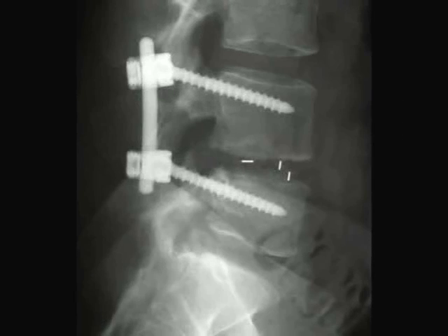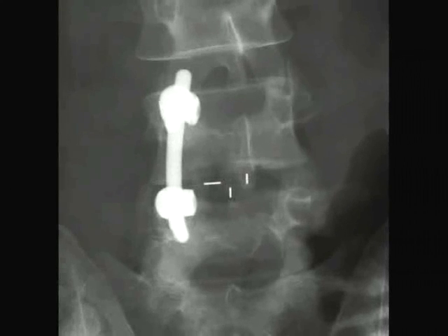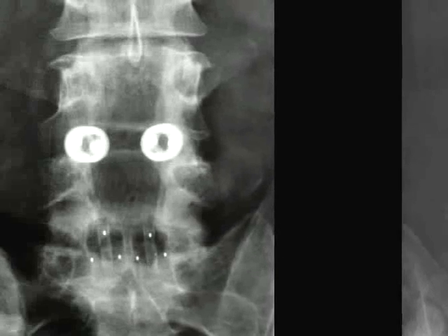This is a patient who underwent the T-lift procedure with the pedicle screws and rods demonstrated, and 3 little radiopaque white markers within the disc space, which are metallic markers that are placed in the implant for verification of implant position. This is what's called an AP view, or anterior-posterior X-ray of the same patient, demonstrating position of the implant and the pedicle screws being placed on one side in this patient.